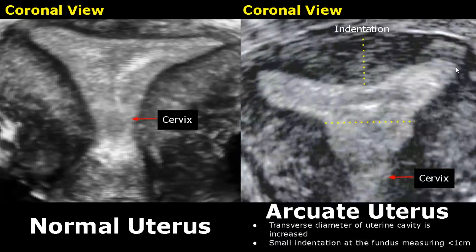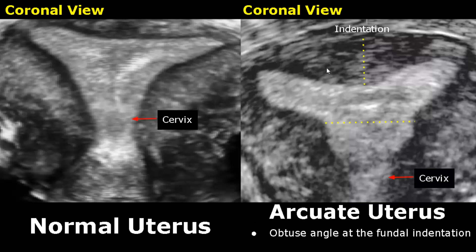An arcuate uterus is the least serious type of congenital uterine abnormality. The transverse diameter of the uterine cavity is increased and a small indentation is present at the fundus, measuring less than 1 centimeter. An obtuse angle is formed at the fundal indentation. An arcuate uterus is actually considered a normal variant of the uterus and has very little association with reproductive failure.